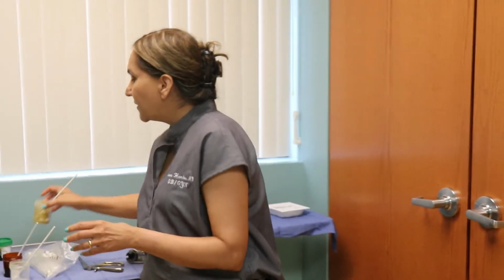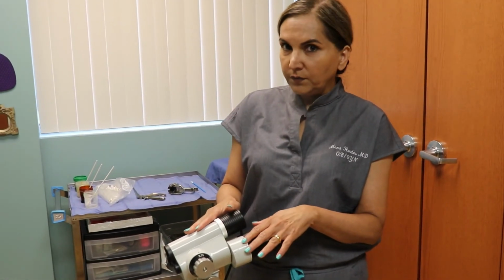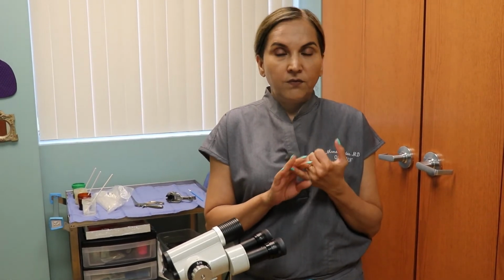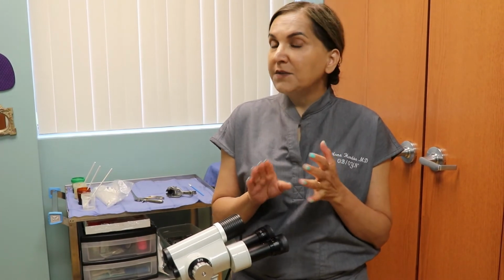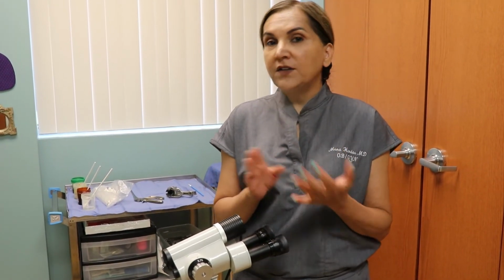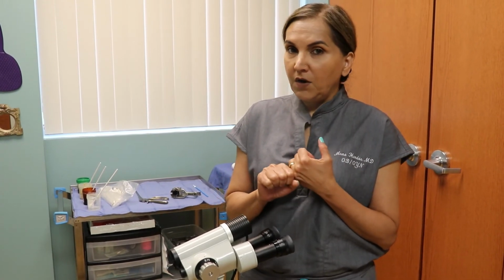So all colposcopy is basically looking at your cervix through the colposcope or the microscope. What is it going to do? It's going to confirm whether you really have an abnormal area, because sometimes a pap smear could be false positive or false negative, right? So it's going to confirm if there's an abnormality.